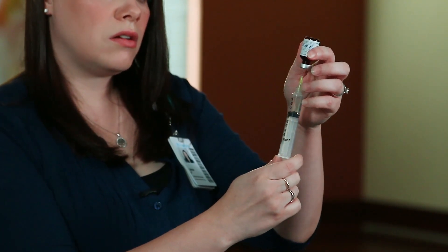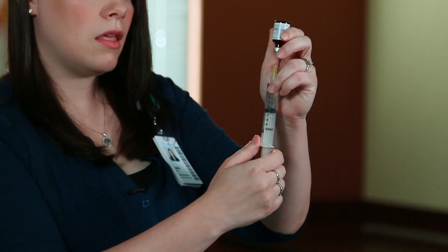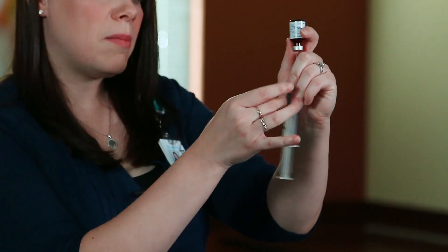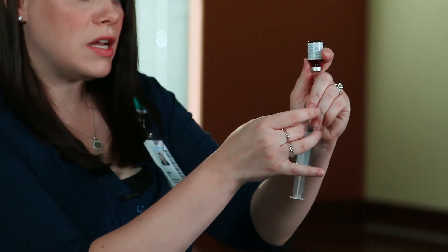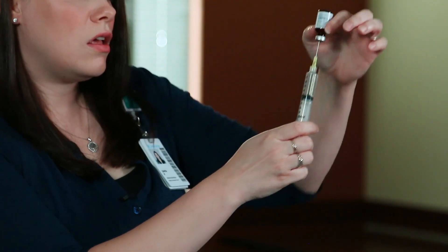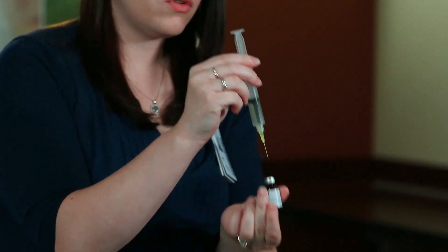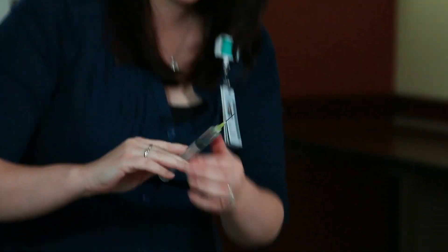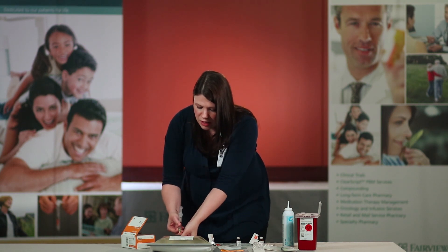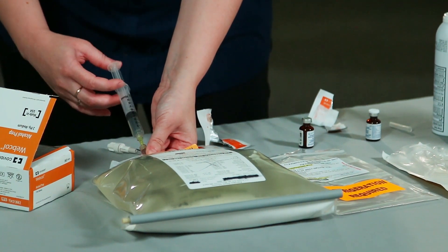Allow the syringe to fill until all of the liquid is into the syringe. If you notice any large air bubbles, gently tap the syringe and push the air bubbles out. Remove your needle and syringe from the vial, stabilize the port of your TPN bag, and place the needle directly in the center of the port. Instill all of the multivitamin.